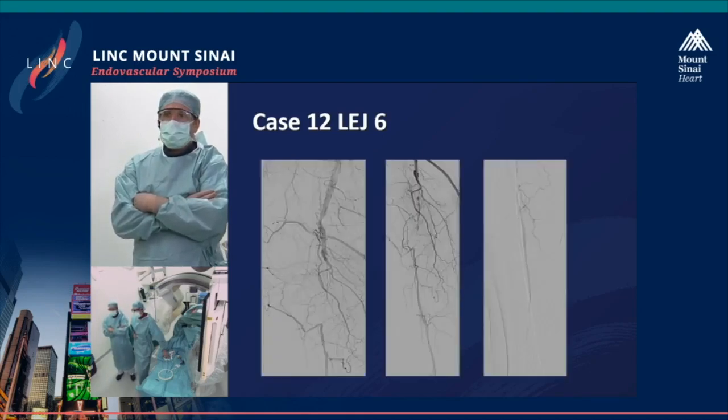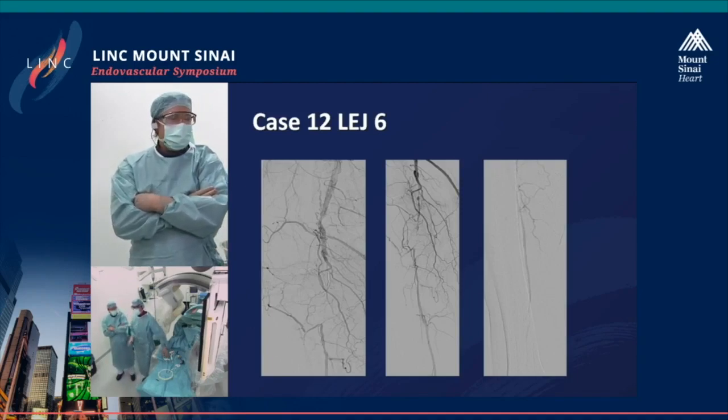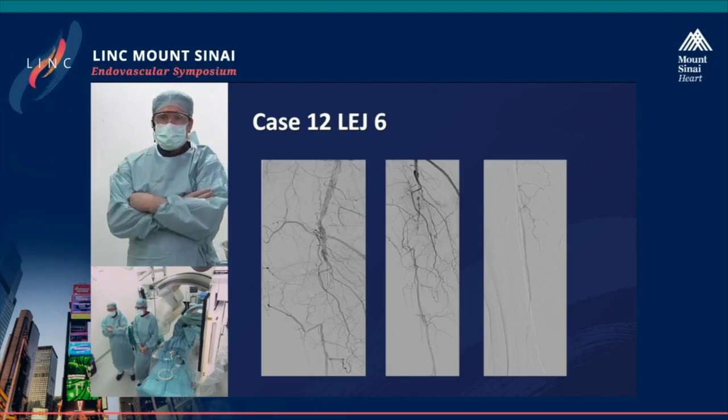This is the angiography. You can see there's actually an occlusion of the distal popliteal artery as well as the tibio-peroneal trunk. And the peroneal artery is the only artery that's going down to the foot and providing the blood supply for the foot arteries.